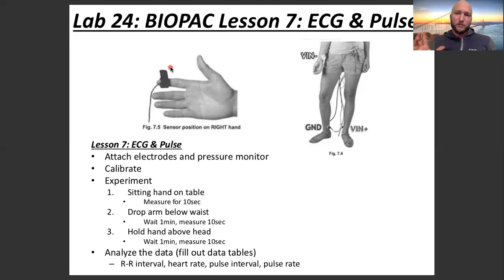When your left ventricle pushes blood into your aorta, it pumps up the aorta like a balloon. And that pressure, that pump up of blood, a wave of pressure goes through your arterial tree. And that's what we're measuring out here on the end of our fellow student's finger. So that pressure wave is generated by the left ventricle, it goes through the aorta, through our arterial tree, all the way down our arm, and it's picked up here. So that's what the pressure monitor is recording.